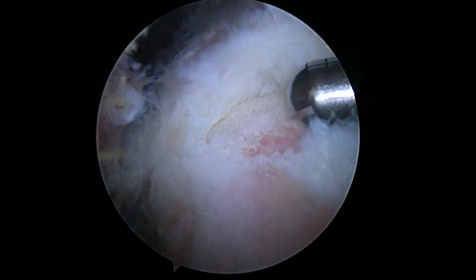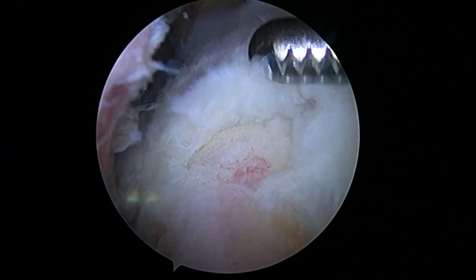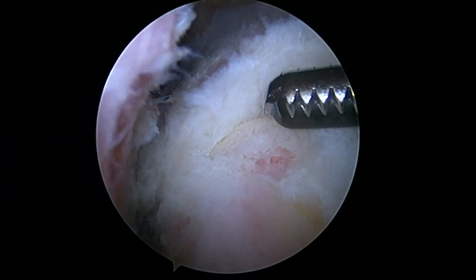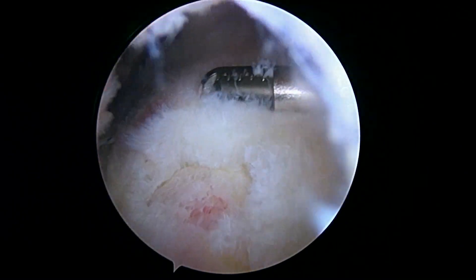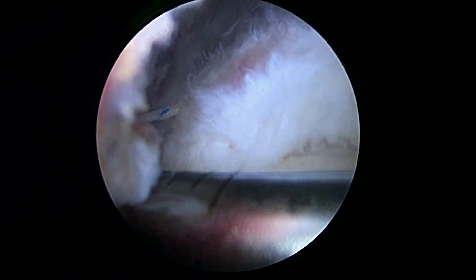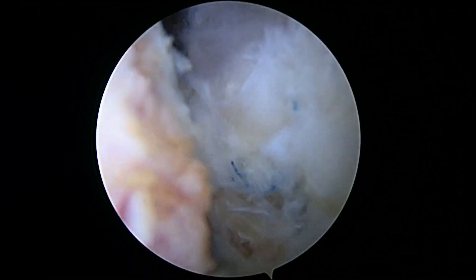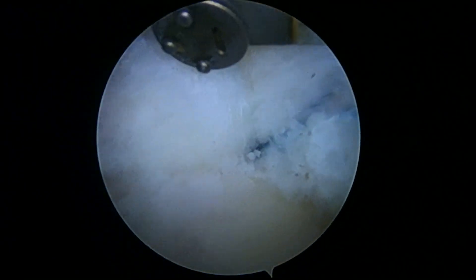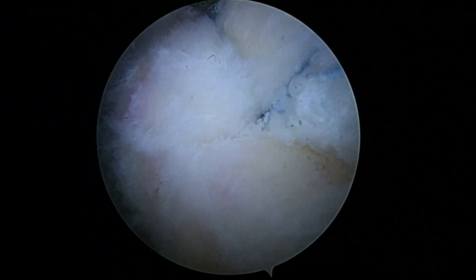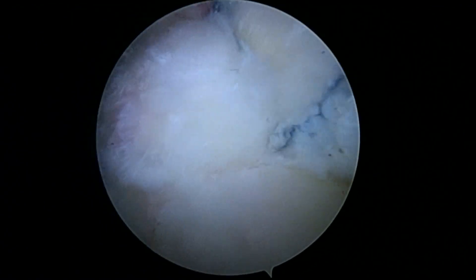We're going to place one rotator cuff anchor down here. So we've got our biceps tenodesis done with an anchor right there. We've got our rotator cuff repair with three sutures right there. I'm going to make a couple little holes in the greater tuberosity to try and take advantage of a little more healing.